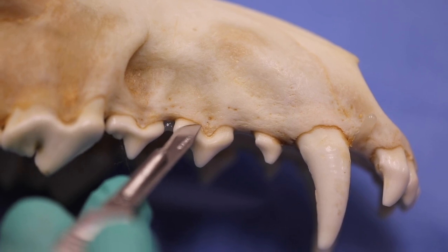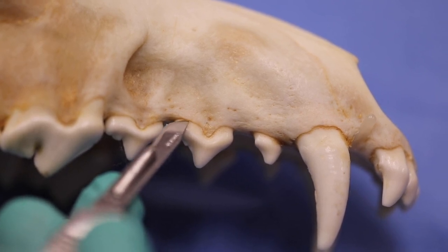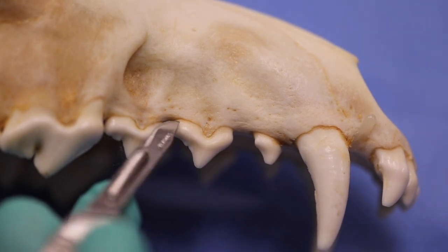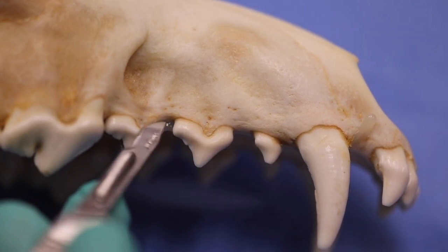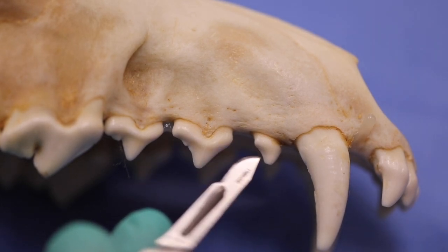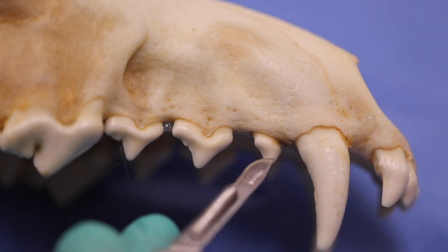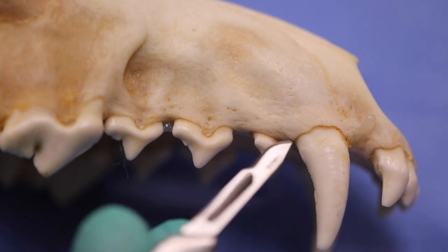So it allows for a very safe approach, keeping in mind that that angulation needs to be present throughout the length of the incision, and you can ensure that your flap initiation will allow for non-traumatic exposure to that bone and make your whole procedure a lot quicker and easier.